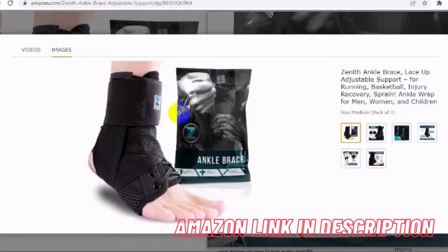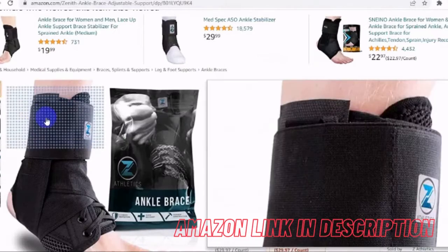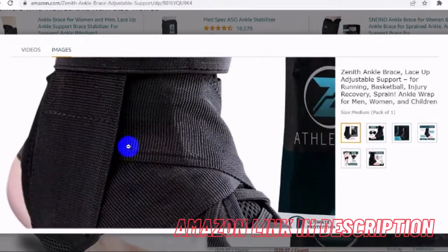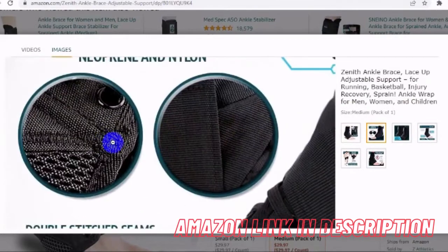An ankle brace that moves with you — invest in an ankle support that will last. Zenith has developed a brace with the end user in mind, made from the highest quality nylon and neoprene so you will get the best possible support and breathability. Double stitched seams also mean you will not have to keep spending your money on new braces every month.